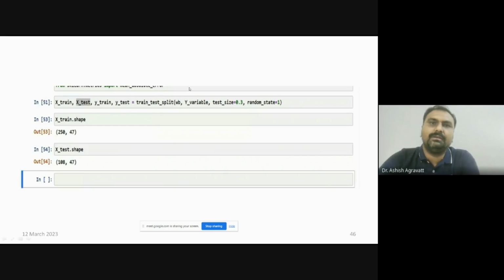So from the data, 70 or 80% is used for training. Then 20% of the data is used for internal validation. And then when we feed the data externally, we perform the external validation. Then the machine will automatically give you an interpretation, for example in amino aciduria or inborn error of metabolism. So we feed the data, 80% goes into the training model, and 20% is used for internal validation. After the internal validation, the algorithm will give you the sensitivity, specificity, accuracy, precision, and everything.